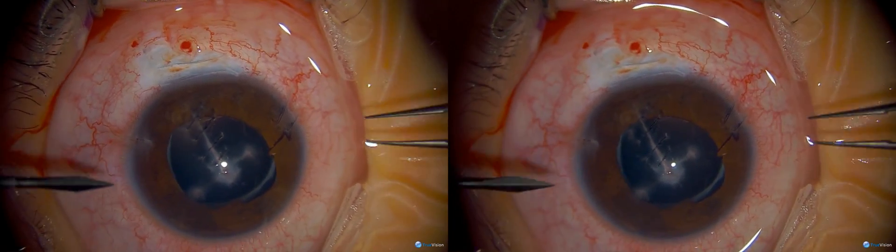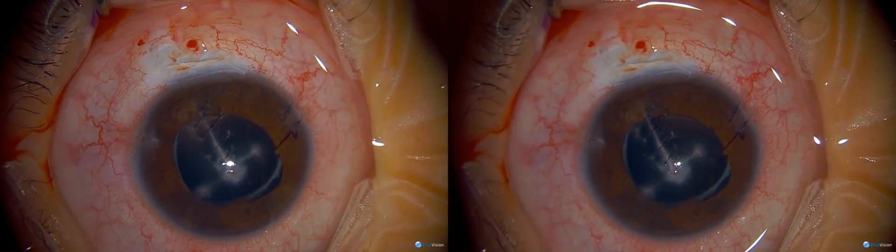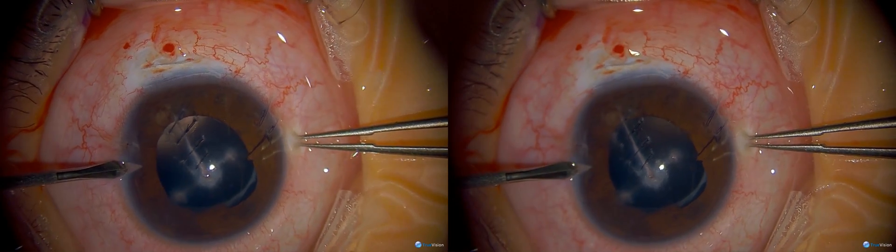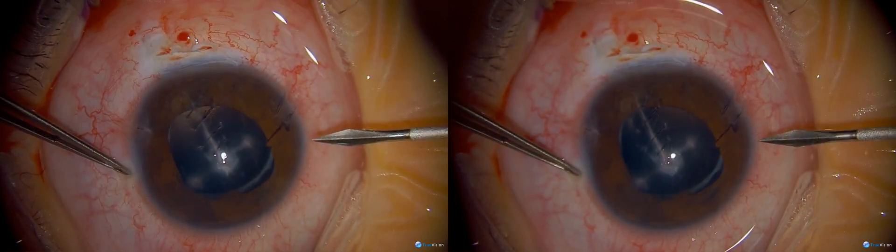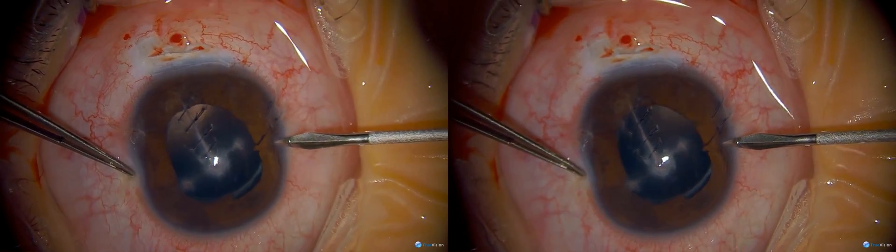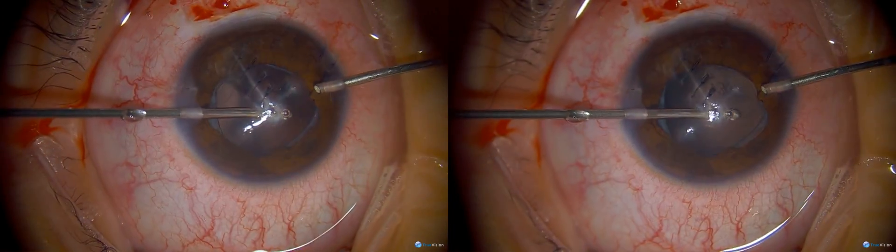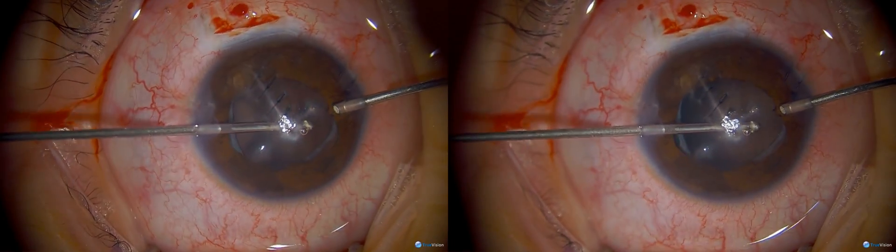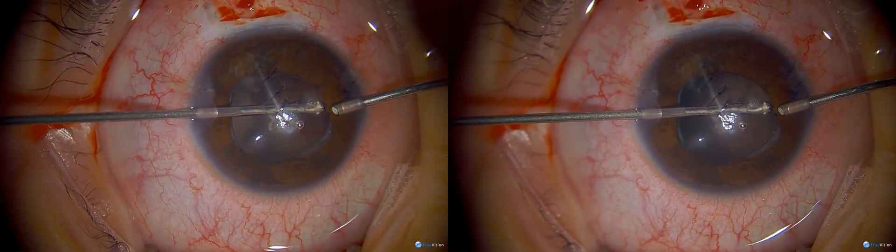This is a 20-gauge MVR blade; we're going to make two ports. Whenever we do a lensectomy in children, we always do a two-port incision. If you're not going to put in a lens, we don't do the scleral incision. The great advantage of using vitrectomy for most everything in children is that you have an infusion that maintains the chamber.